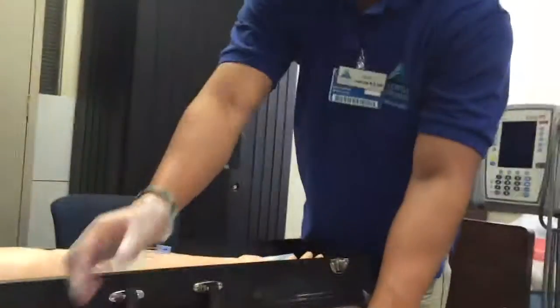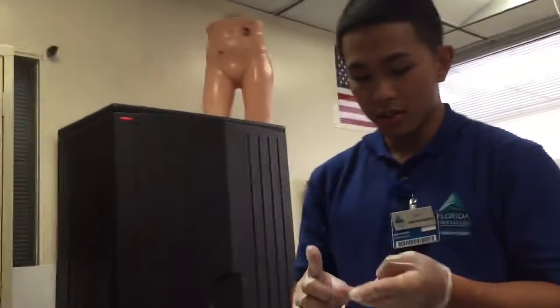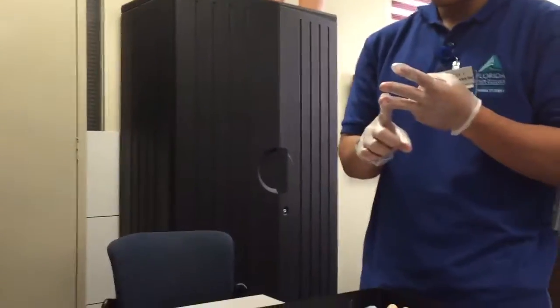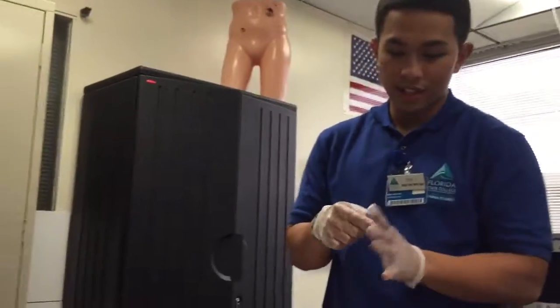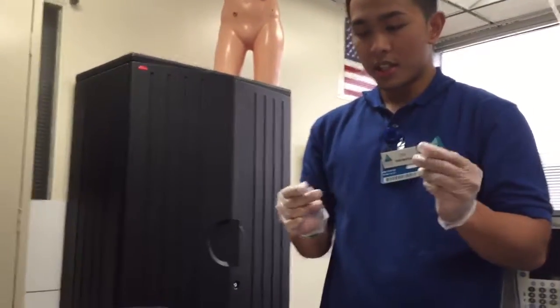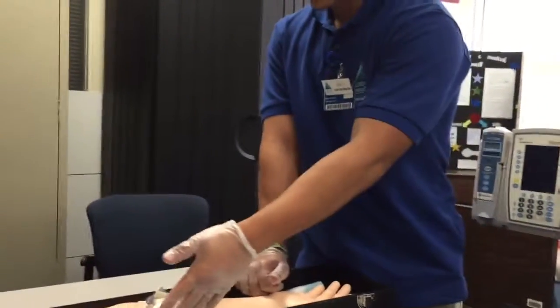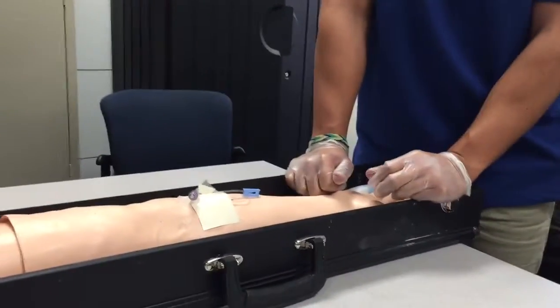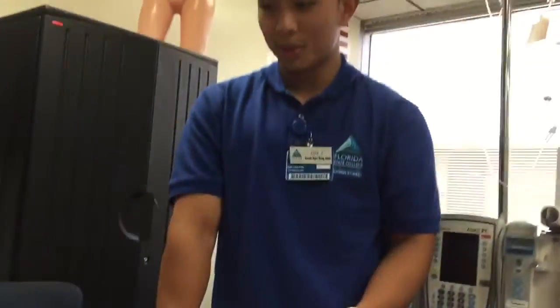So that's good. Now I would document all of my findings. I would document the dose, the route, the medication, the intake and output, and the drug administered, and just verify that with the MAR. And I would check one more time for the condition of the IV site, which it still looks good. The vein still looks like it's open and patent, and it doesn't look like there's any phlebitis or any edema around the surrounding site. And I would make sure the patient understood what was happening, and that would be it.